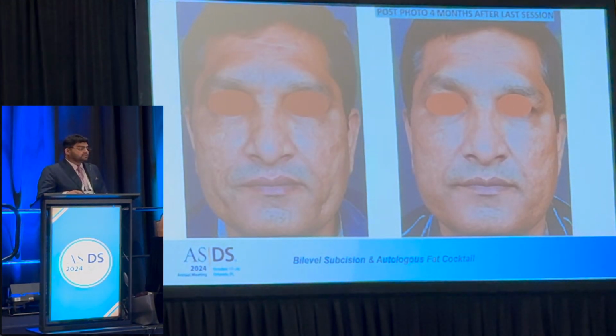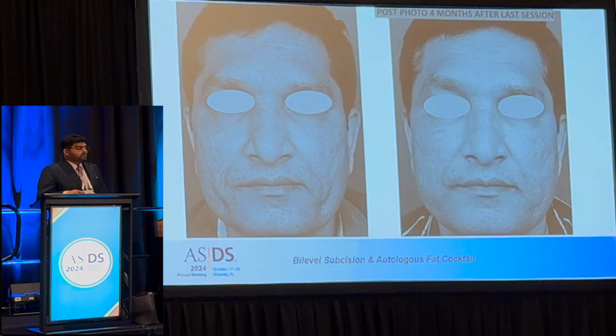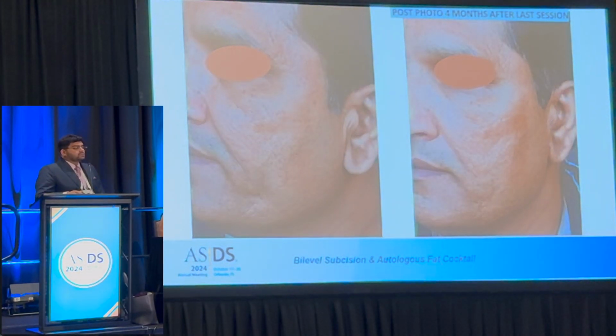This is the final result that we have. The post photo is 4 months after the last session, that's 4 months after the touch-up of microfat that was done. This is in black and white to help appreciate it better. On the right side, we can see there is still some amount of topographical irregularity left.